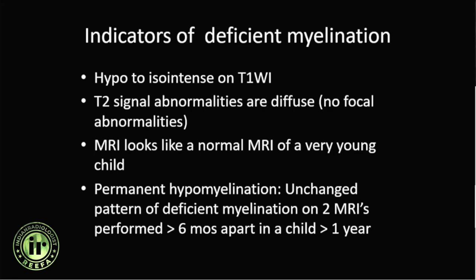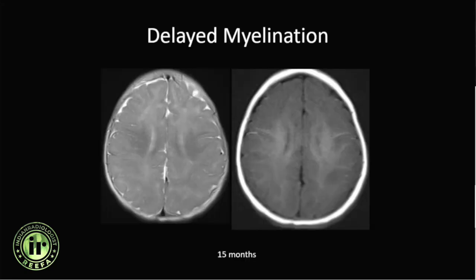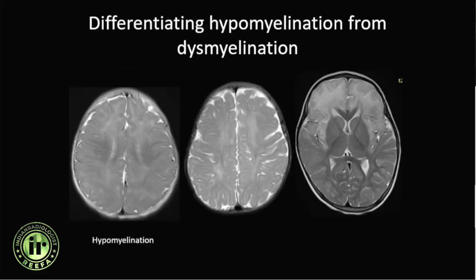A fifteen-month-old child shows diffuse T2 hyperintensity in the white matter, bilaterally symmetric, which would have been normal at three to four months of age. Since this child is fifteen months old, this represents delayed myelination. Hypomyelination with diffuse ill-defined signal abnormality on T2-weighted images should be distinguished from dismyelination, as in Krabbe's disease or Alexander's disease where there is a gradient — there will be no gradient in hypomyelination.